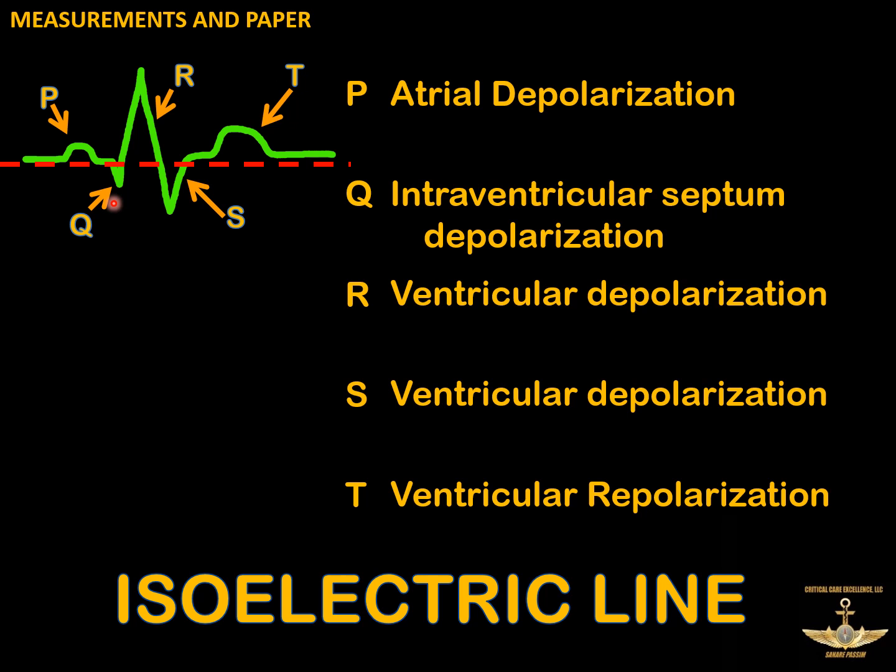And when you think about a Q wave in terms of the QRS complex, the QRS complex is this whole thing. Now, the QRS complex is not always going to have every single Q, R, and S wave. In some leads you don't want that, and in some leads it's not normal. But all those things relate to depolarization of the ventricular system. So Q wave is going to be negative.